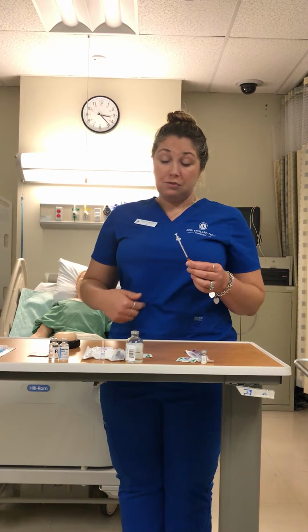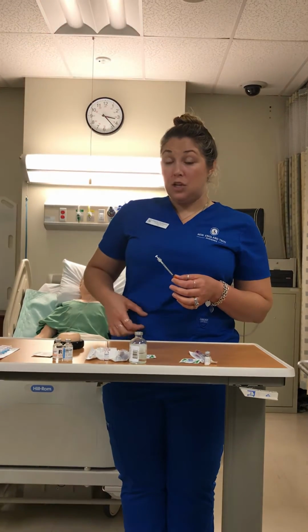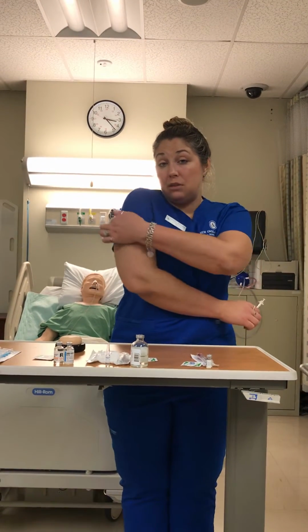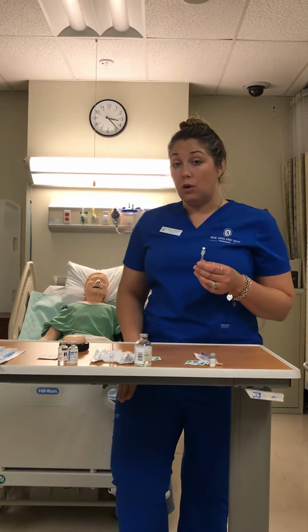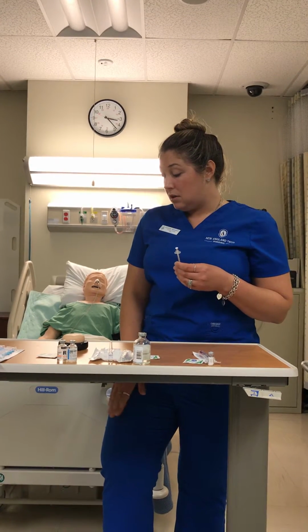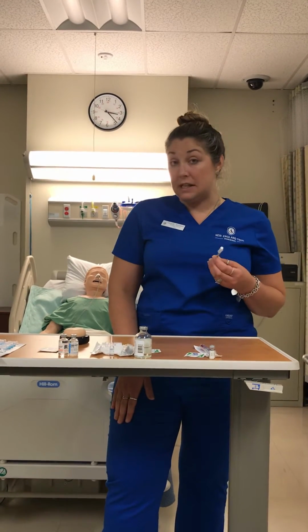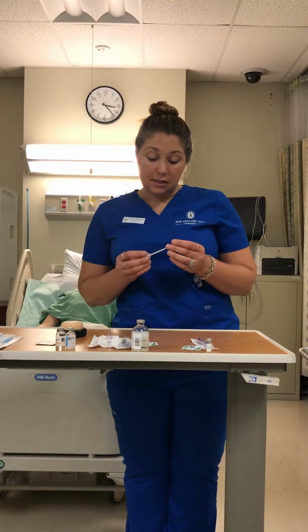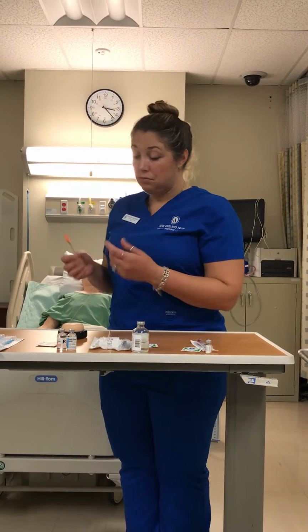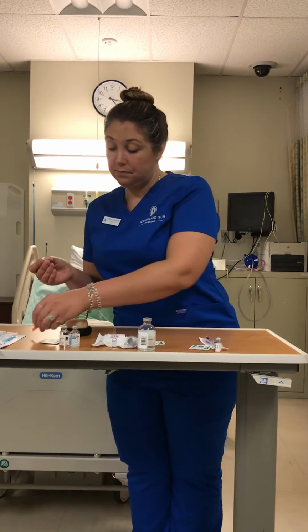You could do 2 inches around the umbilicus, which is your belly button, and you would want to pinch. Also, you could use your deltoid muscle, which is over here, pinch the skin, and then you can also use your thigh, which is your vastus lateralis. To administer insulin, I would put gloves on, and I would take the cap off.